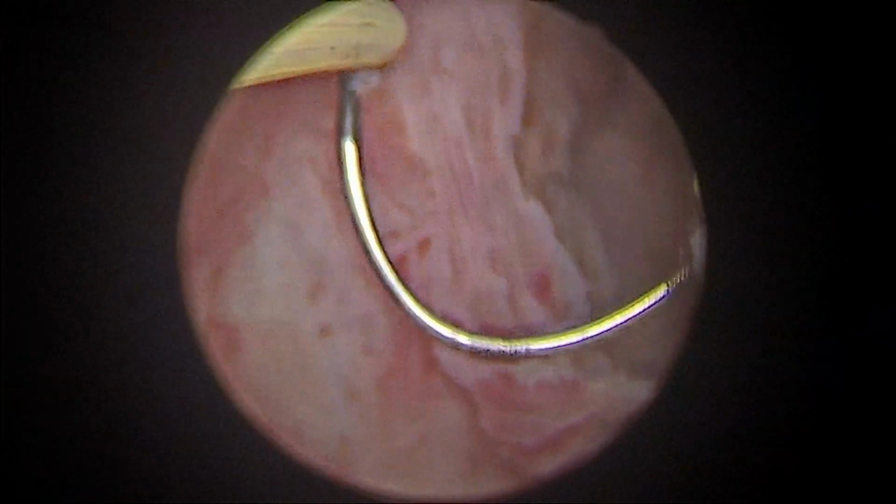So when we did a diagnostic hysteroscopy, we were not able to see any pathology in the uterine cavity. After taking a 2 slice of endometrium, now we are able to see the myoma below the endometrium. And after making a uterus massage, after removing the resectoscope, we are able to make the type 2 myoma into type 1 myoma. And now we can resect it.